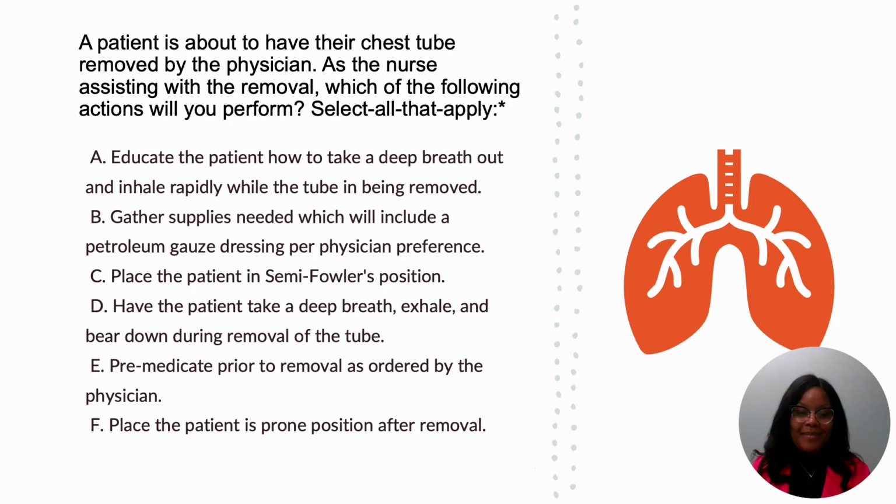E, pre-medicate the patient prior to removal as ordered by the physician? And F, place the patient in a prone position after removal. So I'm going to give you some time to think about it. So this is a select all that apply. So if you chose B, C, D, and E, you are correct.